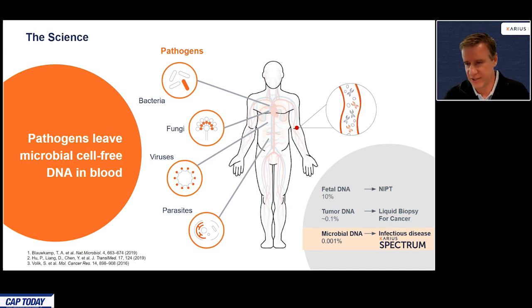The technical challenge is alluded to here in the bottom right, where you see the relative amount of your DNA of interest against the background of other types of cell-free DNA that are present in the plasma.